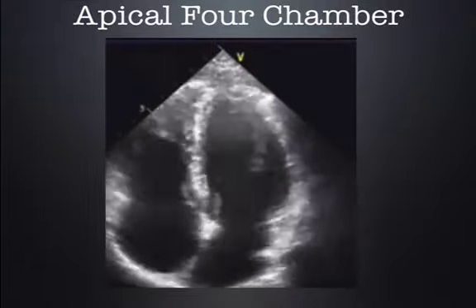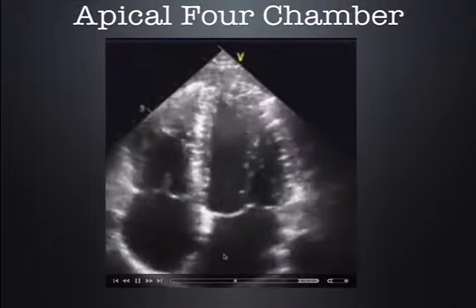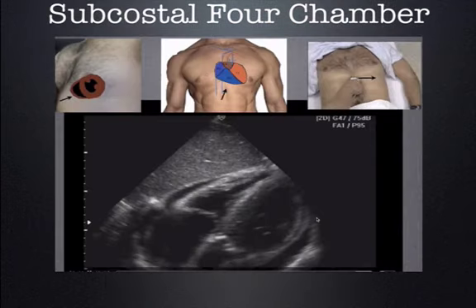This is the view that you should get. Again, left ventricle, right atrium, left atrium. Another view that is often used by emergency physicians, particularly those with not a lot of experience in echocardiography, is the plain old subcostal 4-chamber view, and this is a fine view to use.